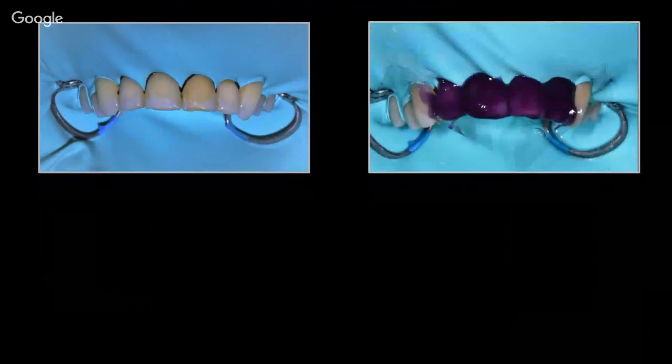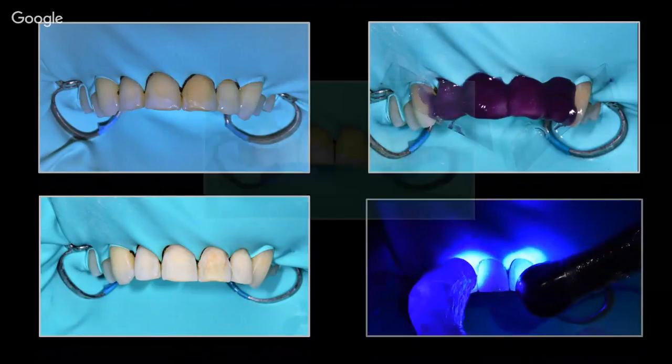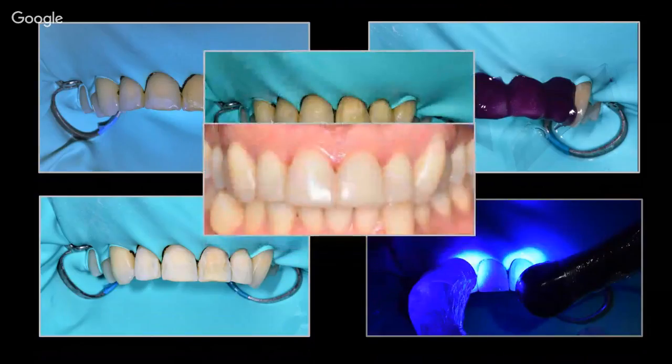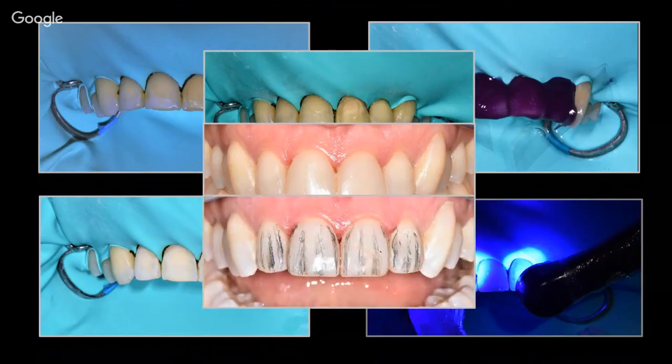So let's see one more time what we did. The very tiny teeth preparation. And finally, we studied a lot of anatomy. We have a project in our mind, so let's make it real. With just a pencil, we can mark the tooth surface we want to change, we want to ameliorate.